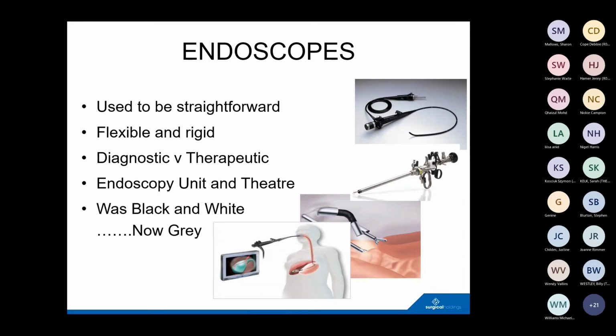That didn't take off totally, but there was a lot of interest in it from a technological development perspective and also from a surgical perspective. But the principal issue with that was the limitation of the outer diameter. Obviously, the outer diameter of the instrument is small, and therefore, for example, scissors were a particular problem. Getting a small scissor through a small channel and then getting good cutting with it proved to be quite difficult. But it's an illustration of how grey it's become.